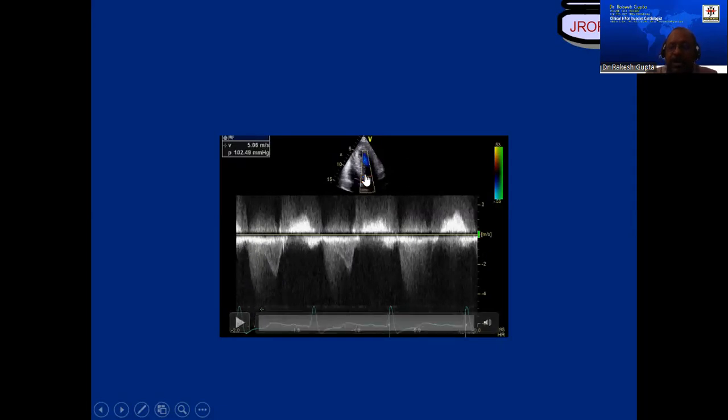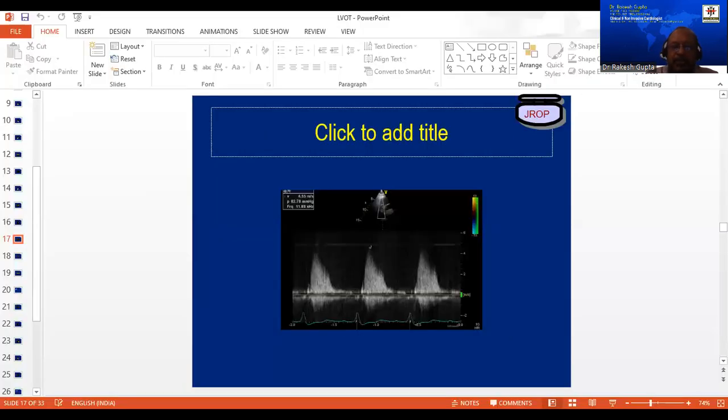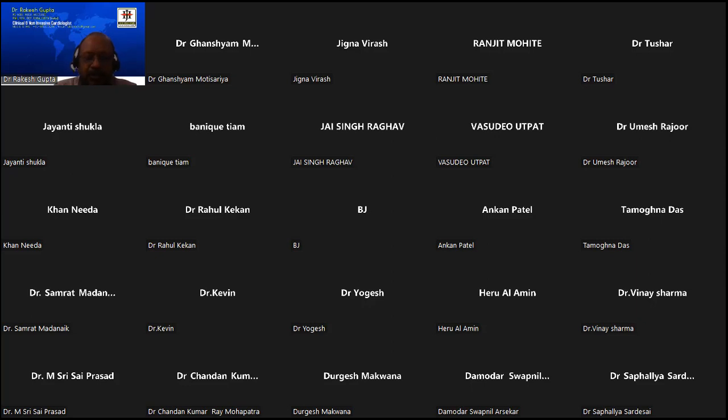So this patient was carrying not only an LVOT obstruction because of significant LV hypertrophy, but also severe aortic stenosis. The gradient is almost 4.5 meters in the suprasternal window. The patient was having both aortic as well as subvalvular stenosis, both components. Supravalvular, I'll show you. I think I have one supravalvular, I just took it out. Supravalvular, it was in aortic, not in aortic stenosis. All right, any questions about aortic stenosis further?